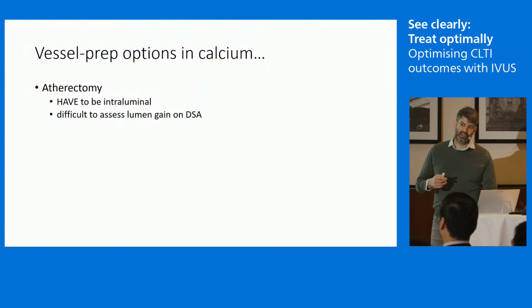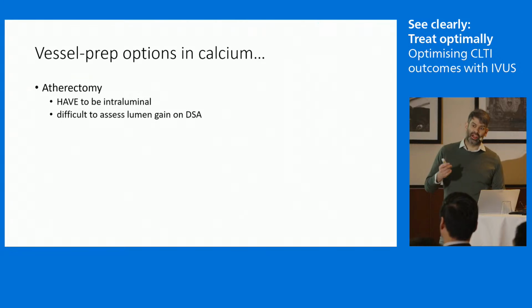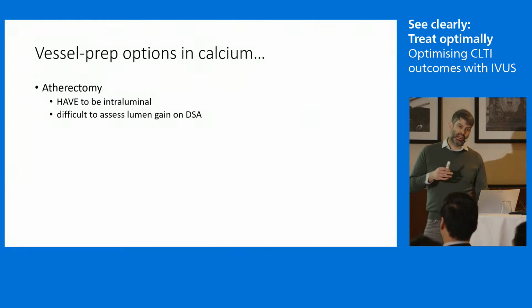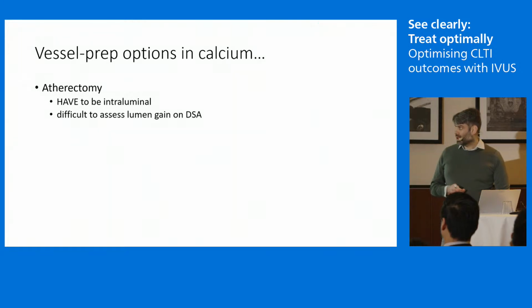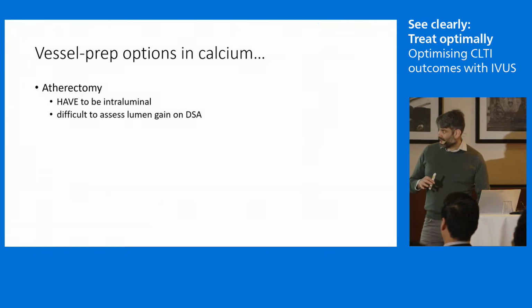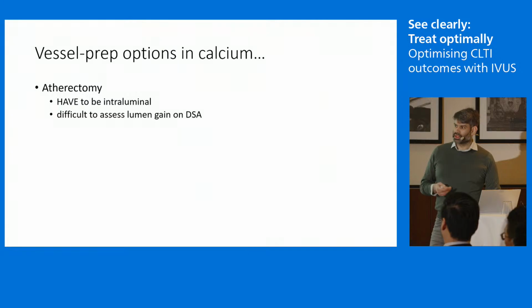In our experience, when we started mandating IVUS use before doing atherectomy, our perforation rates dropped way down. In fact, I can only think of one case of perforation with Phoenix atherectomy since we started using IVUS, whereas we'd had maybe 3 or 4 out of 60 cases before that. Using IVUS just guarantees that your wire is intraluminal before you put a device with blades into the artery.